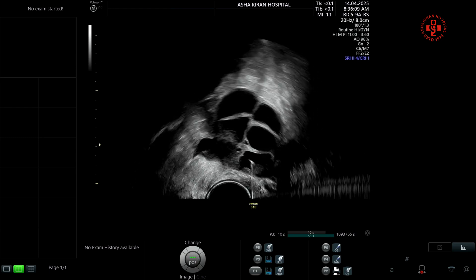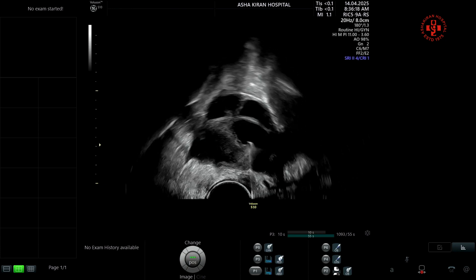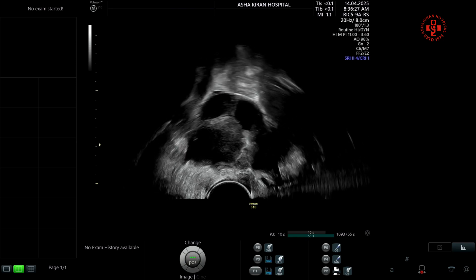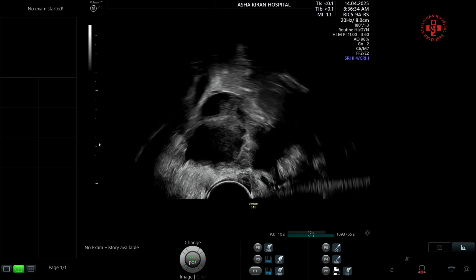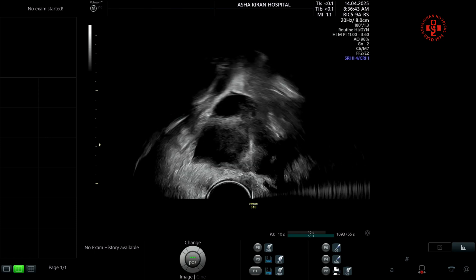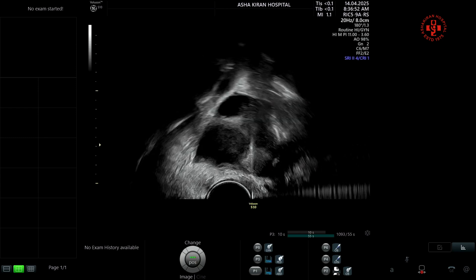Here we are going to explain the technique. The needle is coming from below. The first part you should know is where the endometrioma is located. You should start by slowly aspirating the follicles at the periphery of the endometrioma, and you should not cause any damage. These ovaries are usually fixed ovaries, so the needle and probe must move in a very steady manner into the follicles for follicular aspiration.